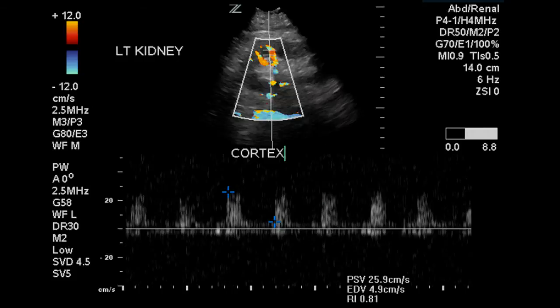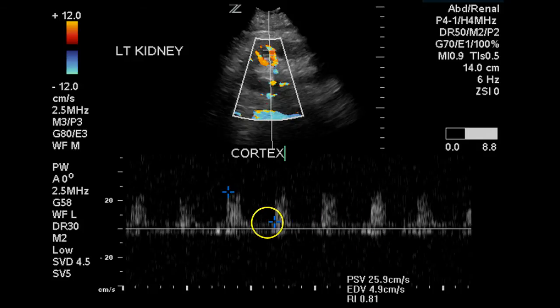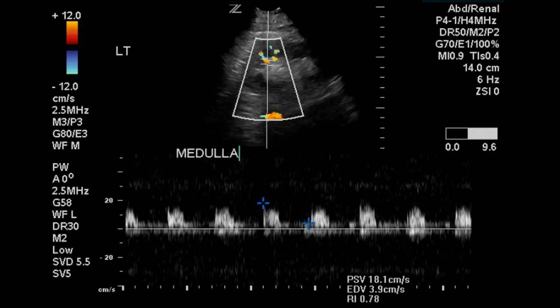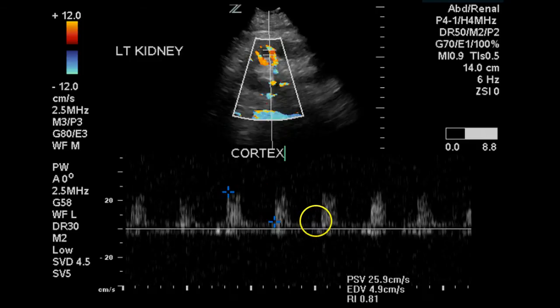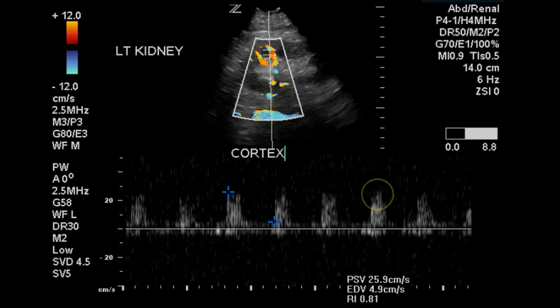This is a Doppler waveform from the cortex of the left kidney, likely an arcuate artery. We have a resistance that is greater than 0.8 — it is 0.81 — and a very low diastolic flow. In the central portion of the kidney, we have another resistive index that is close to 0.8 with low diastolic flow. Both this waveform and the previous waveform have a nice straight upstroke. High resistive indices are not a sign of renal artery stenosis; they are a sign of renal disease.